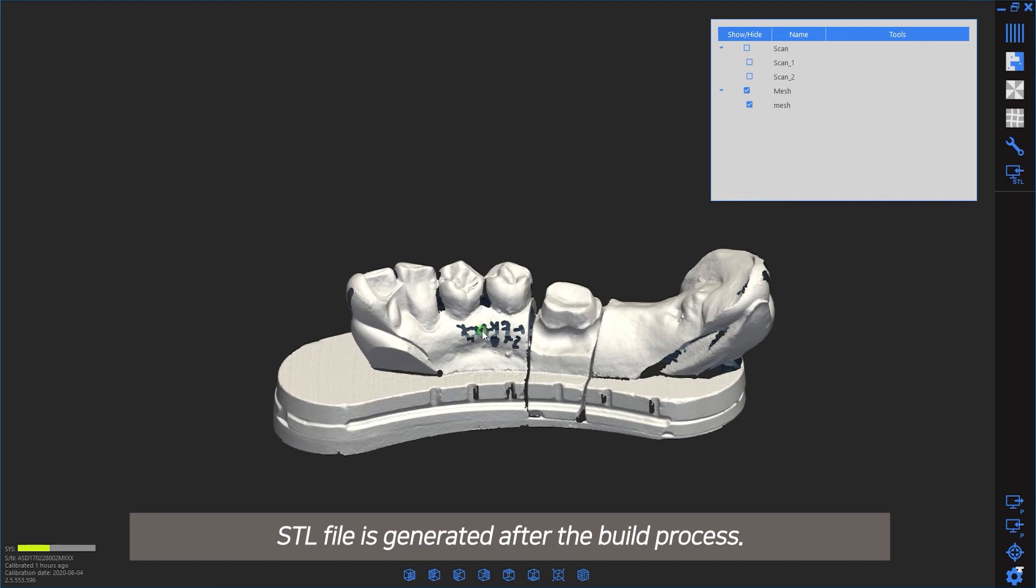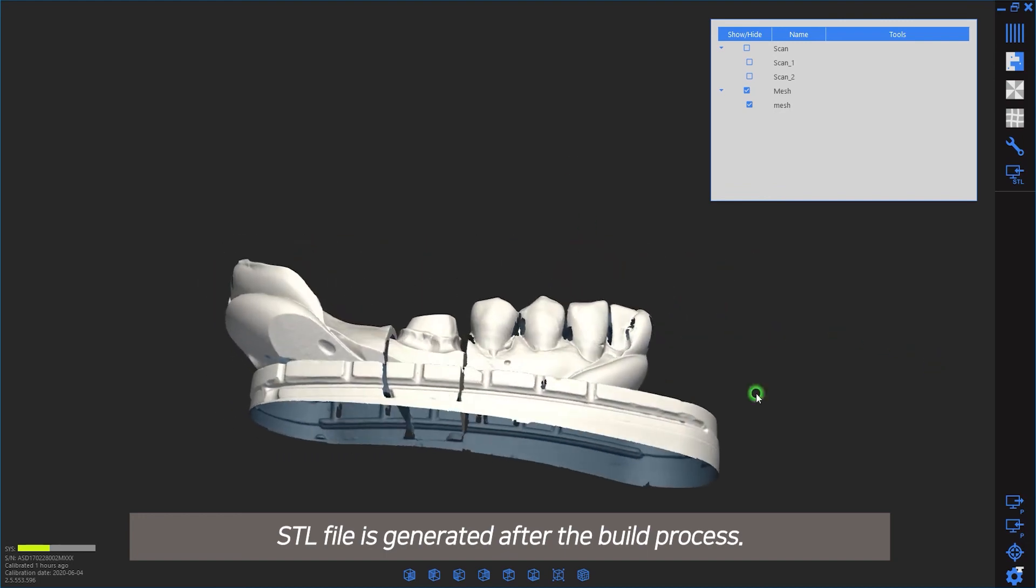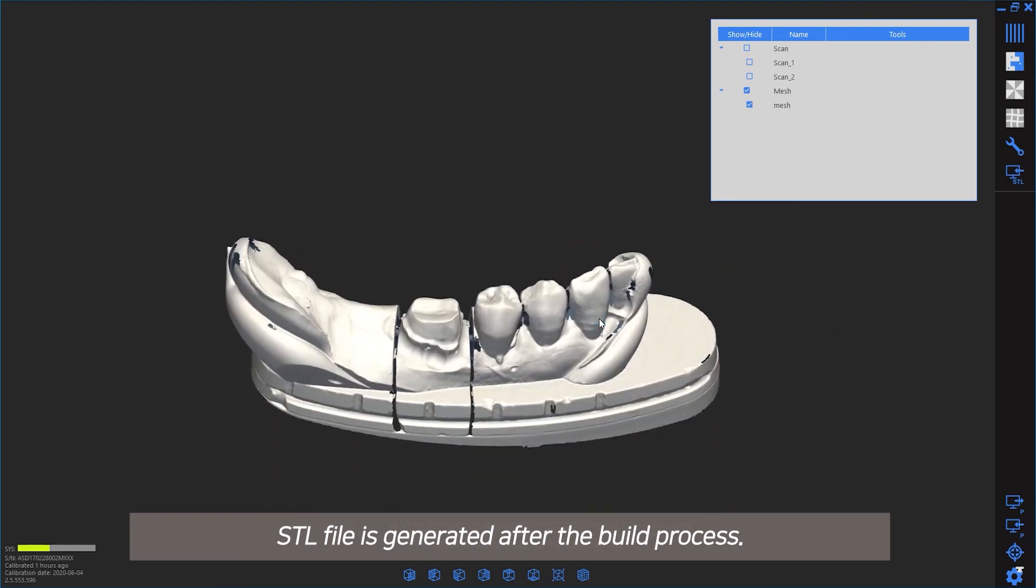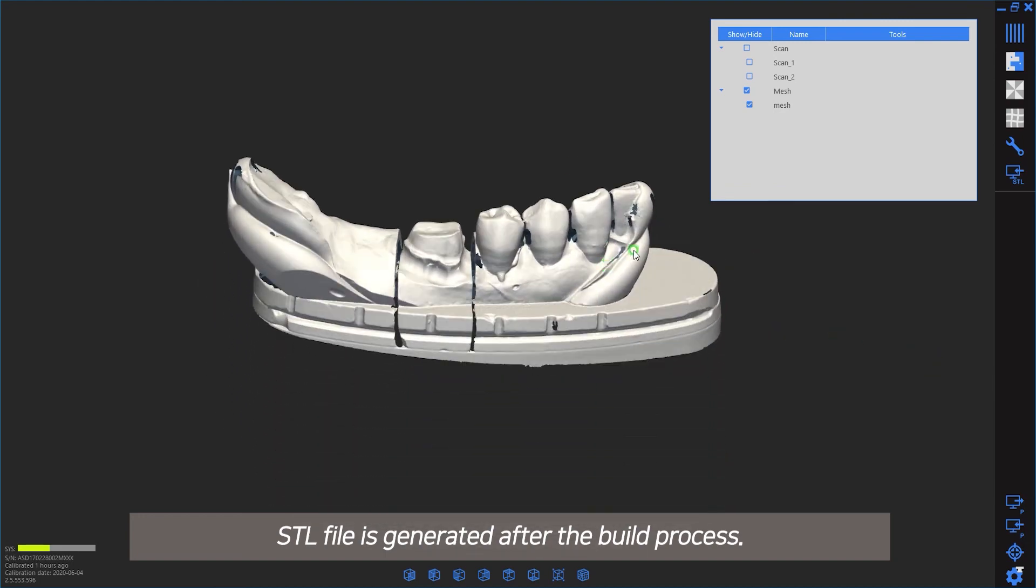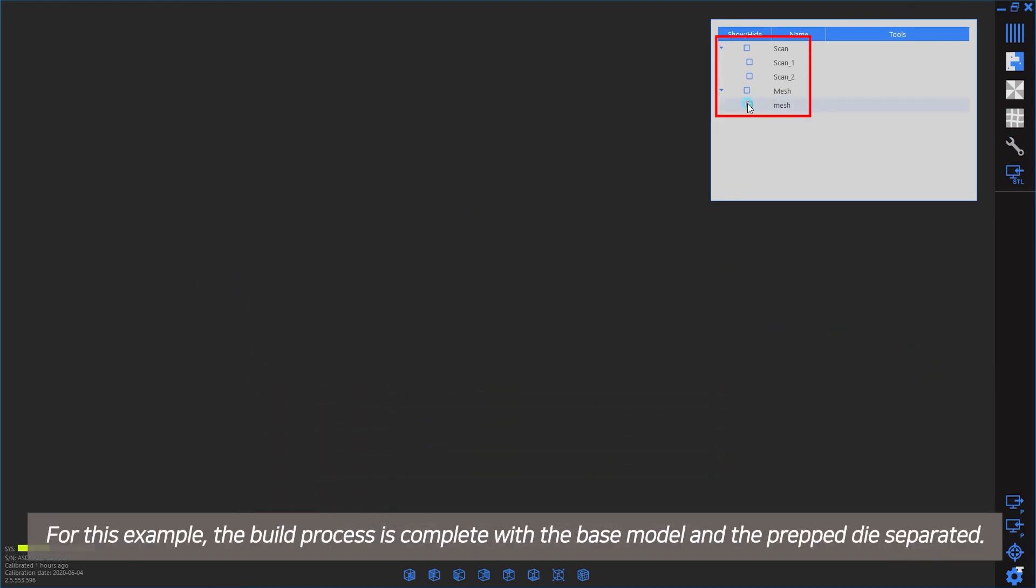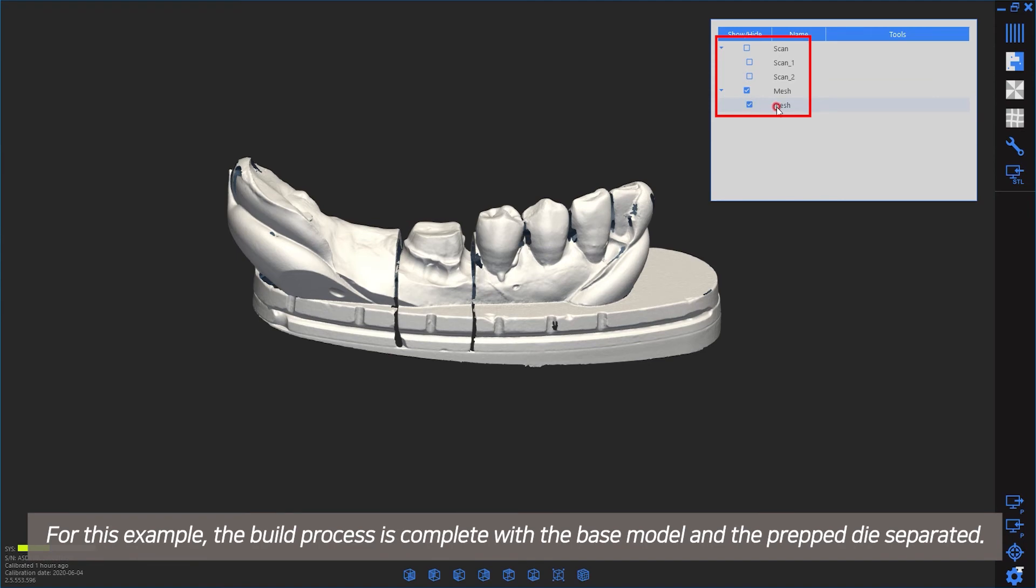The STL file is generated after the build process. For this example, the build process is complete with the base model and prep die separated.